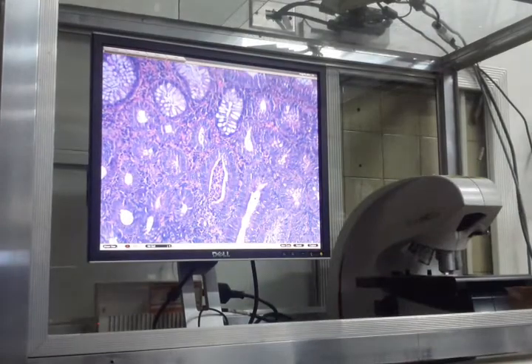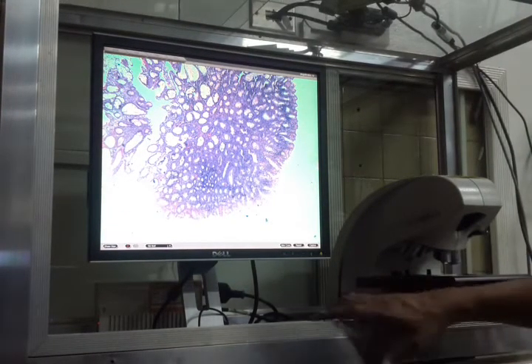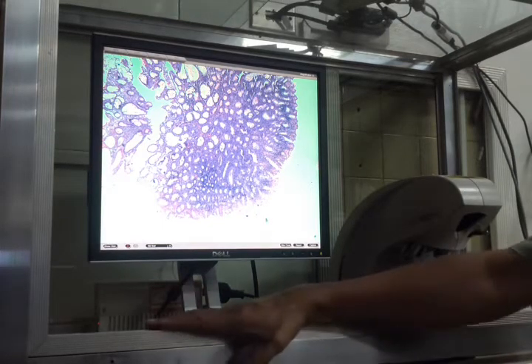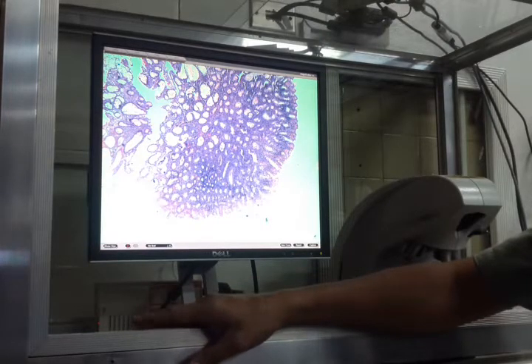Look at the architecture. It forms glandular structures, tubular structures, tissue of origin, glandular epithelium. It is benign, although it has dysplastic changes. This is an adenoma. Specifically, because of the architecture, you call it a tubular adenoma. It is a pre-malignant condition. You already have dysplasia. Okay?